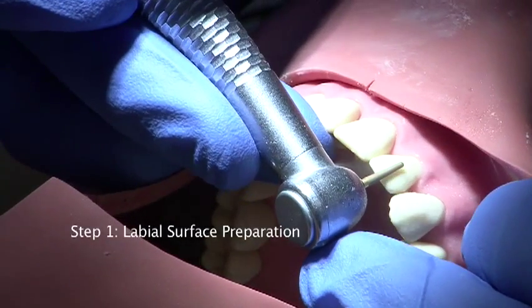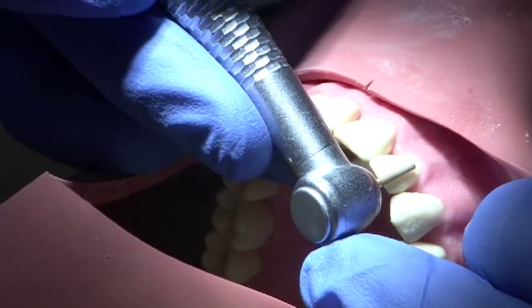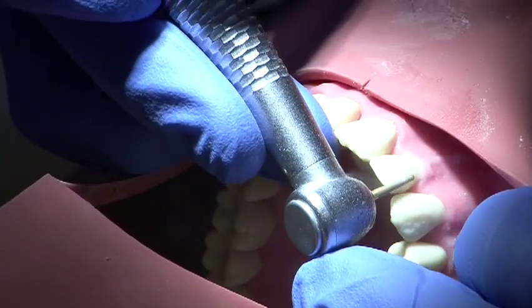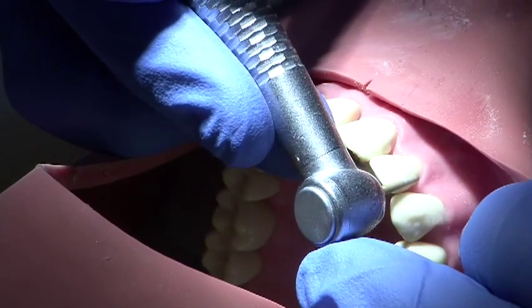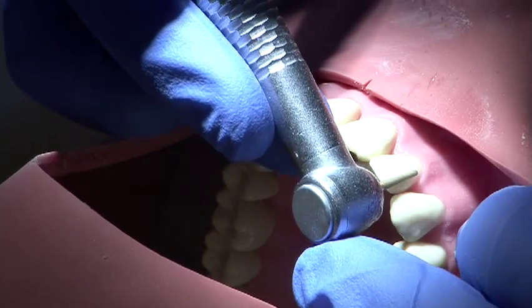The labial surface is prepared to a depth of 0.5 to 0.7 mm. A fine grit burr will ensure a more smooth finish and the burr hand is supported at all times. Follow the natural contour of the tooth to give even reduction and use your putty matrix to ensure that this has been achieved.